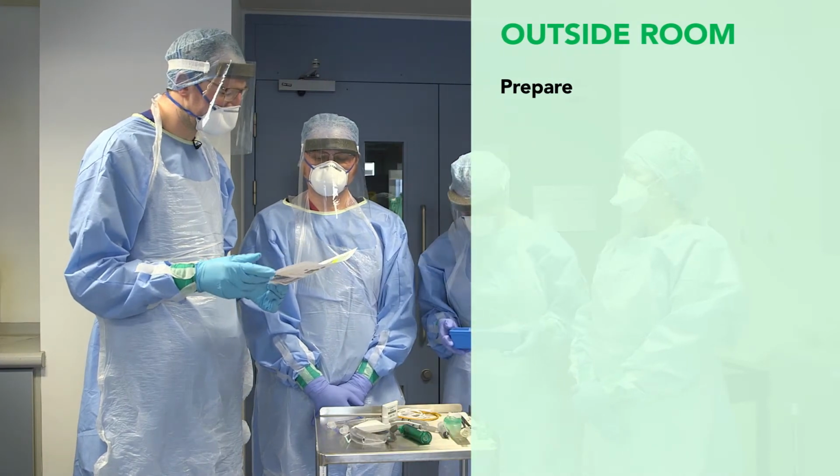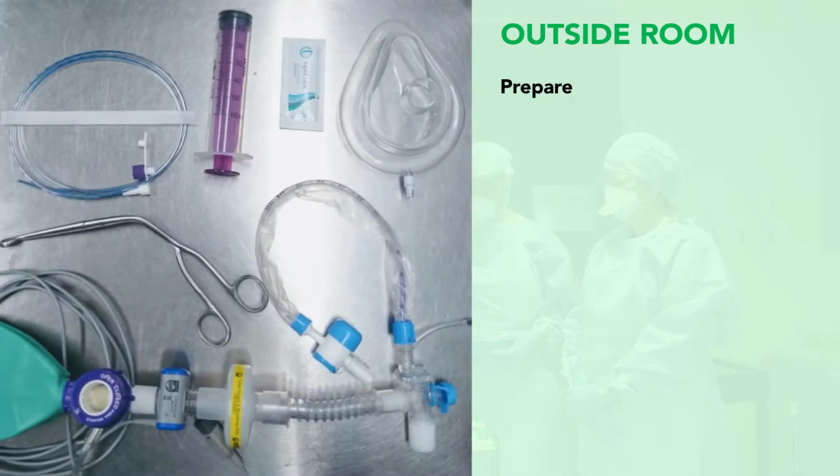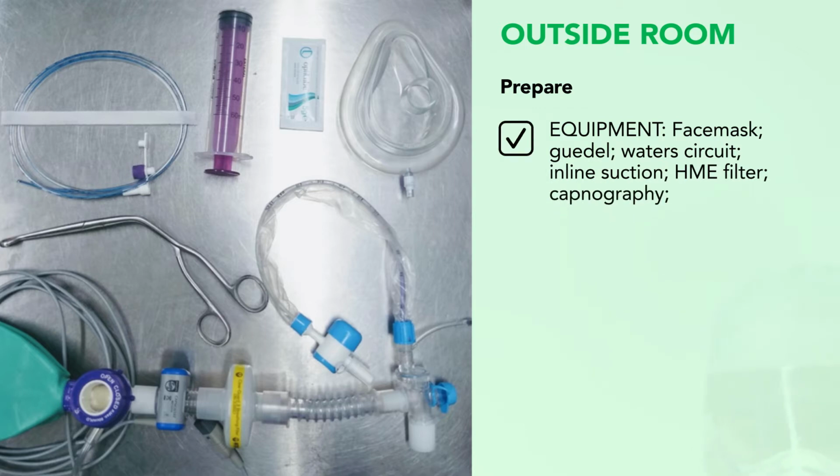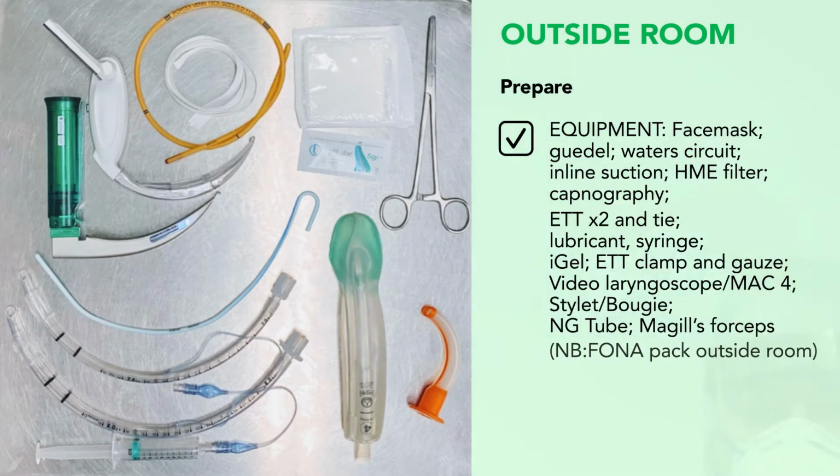Okay, so we're going to go through the equipment. So this is all pre-prepared on the intubation trolley, and this is going to go into the room with us. So we have a face mask, Guedel, we have a water circuit with inline suction, HME filter and capnography, which have been pre-arranged. We have 2 endotracheal tubes. We have lubricant, a syringe, an i-gel, an ETT clamp and gauze. We have a video laryngoscope and MAC4. We have a stylet and bougie available. And we have an NG tube and Magill's forceps. Of note, the front of neck access pack is outside the room and can be accessed from the airway trolley.